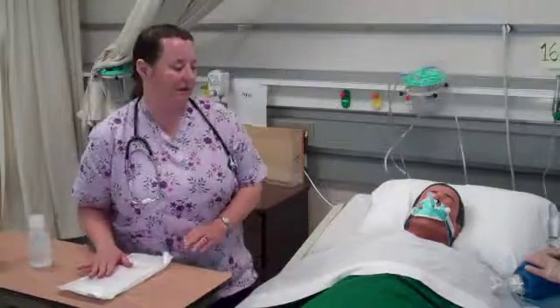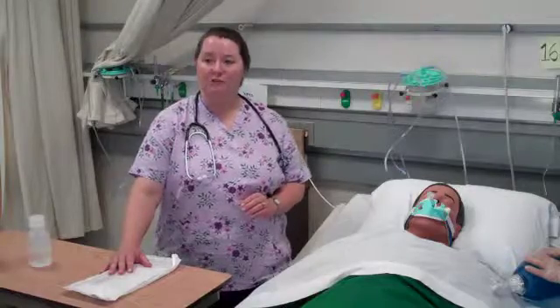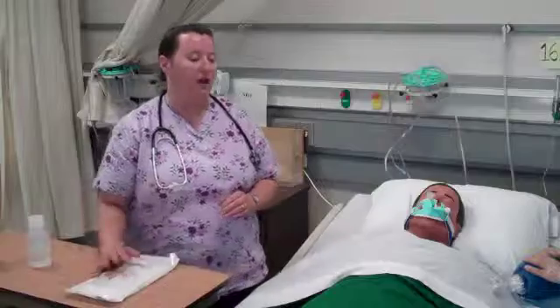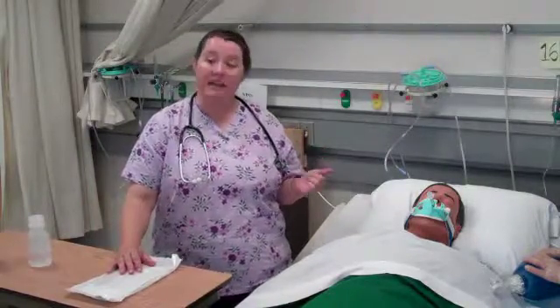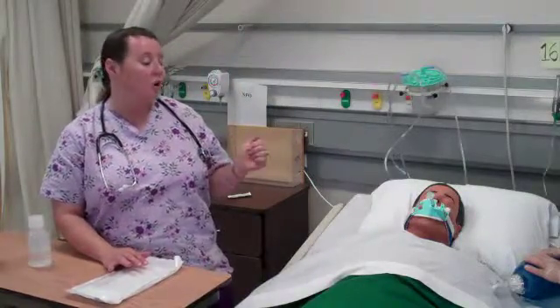I'm doing a demonstration right now on endotracheal suctioning. This is an invasive procedure. We need to make sure that we have a doctor's order for this procedure. Most times an endotracheal patient is in the ICU and you have standing orders available to you for intermittent suctioning if the patient's condition warrants it.